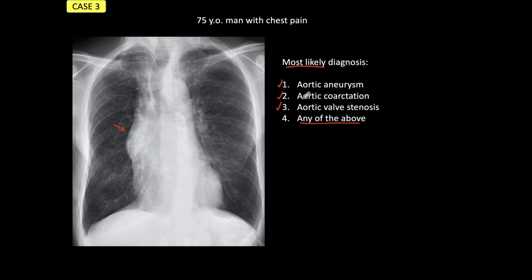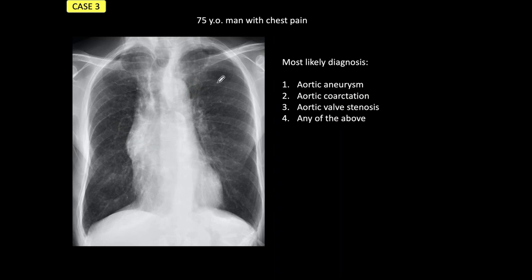Aortic aneurysm is a possibility. Aortic coarctation is excluded because we don't see any abnormality in the aortic arch — no figure of three, no other abnormality, no rib notching. It could be aortic valve stenosis, but if we look carefully, we see a calcification in the periphery of the aorta and a coarse calcification in the inner part of the aorta — indicating the aorta is markedly dilated. So our first diagnosis should be aortic aneurysm.